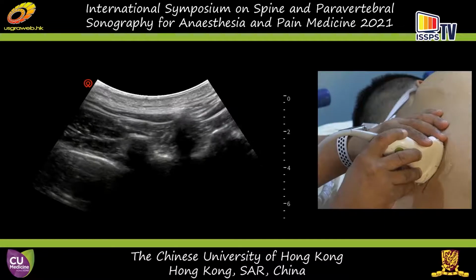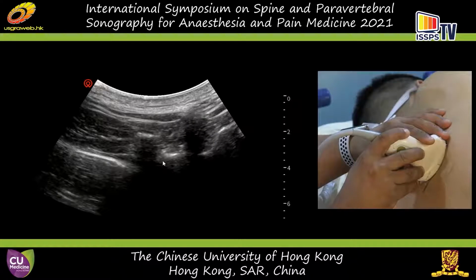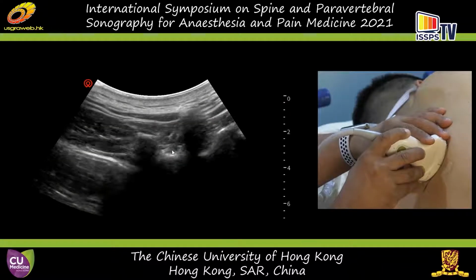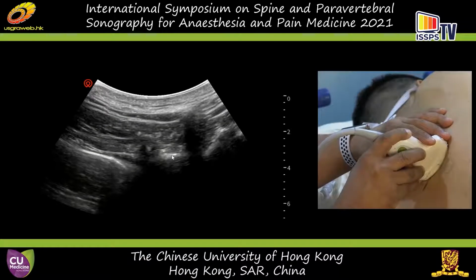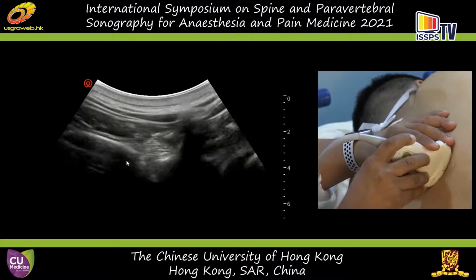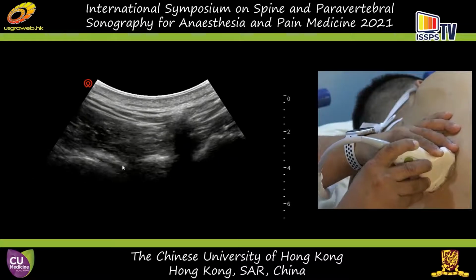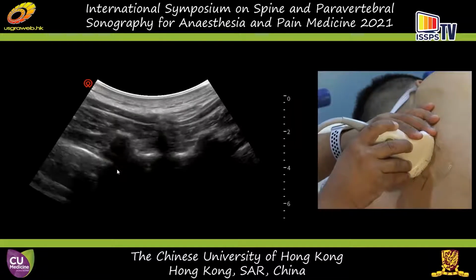You can also see that the transverse processes are much shorter here, as Bernard and Ken alluded to. And then if I go just below the transverse process, you see the articular process, and you are able to see the large apical part of that space. So you can see here there's a large, often wider space. If I go to the next one below, the space appears quite large. So I find paravertebral injections in the lower part much easier than in the upper parts.